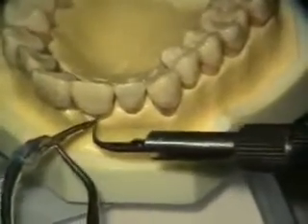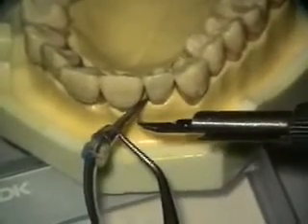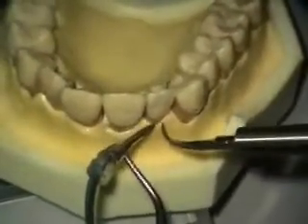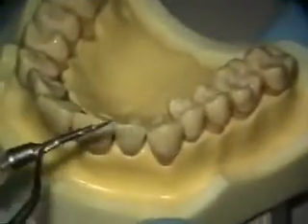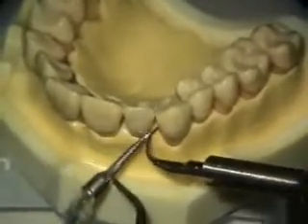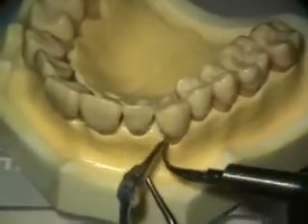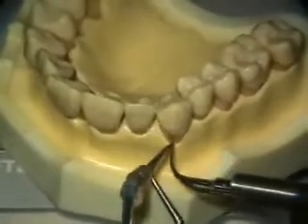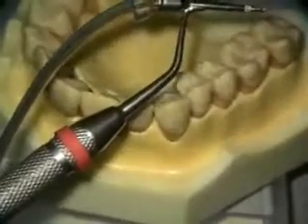Okay, get in here. Sometimes you have to contend with the lip getting over the camera. One of the things I'm looking at is different kinds of retractors, lip retractors and stuff like the Optragate, or these retractors I got from a friend of mine, Mark Gottlieb, in New York. Really affordable retractors, and they get everything out of the way. So you can go into here, and then pretty much you're done with the right explorer.